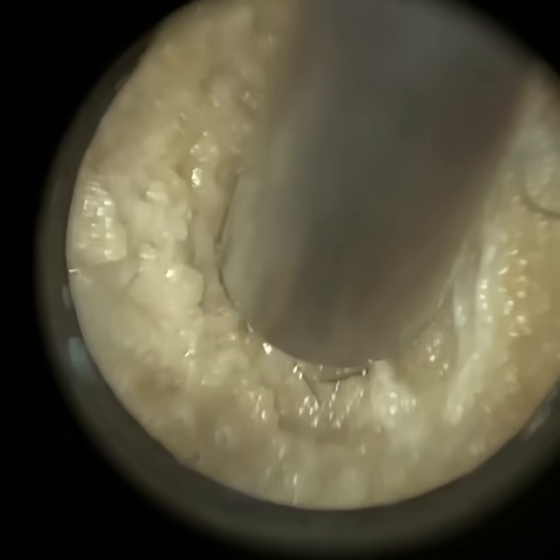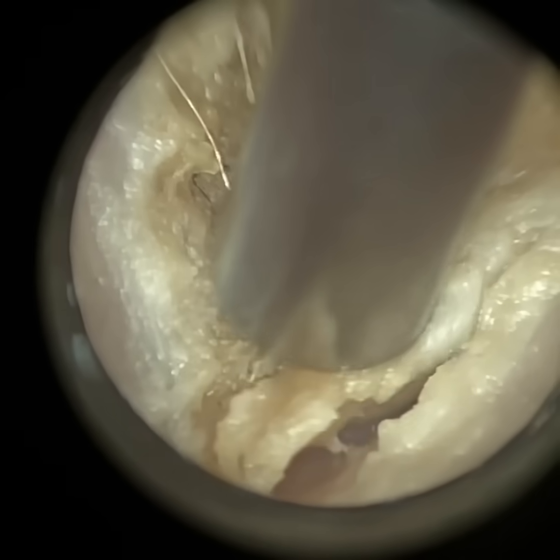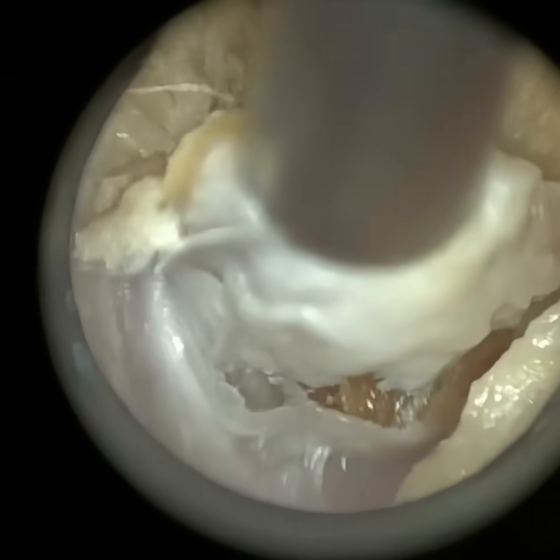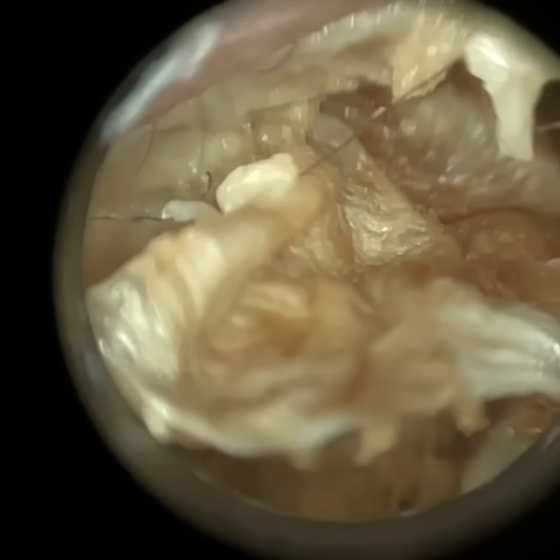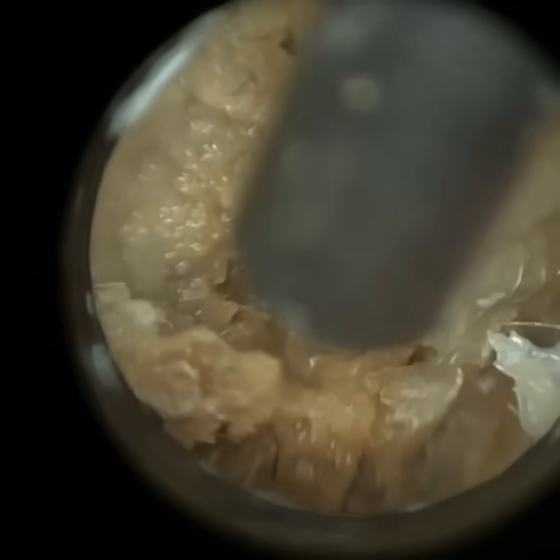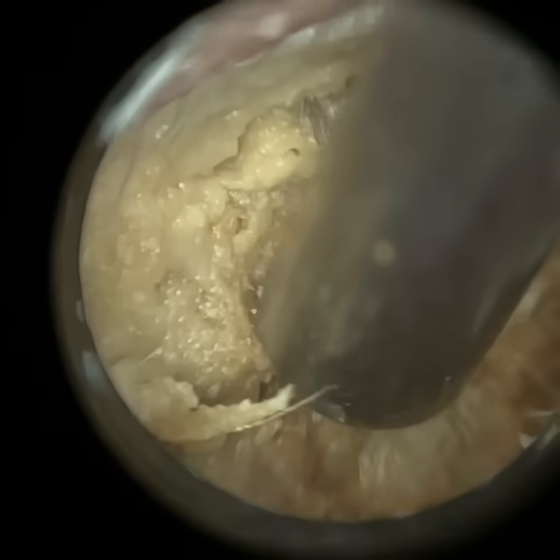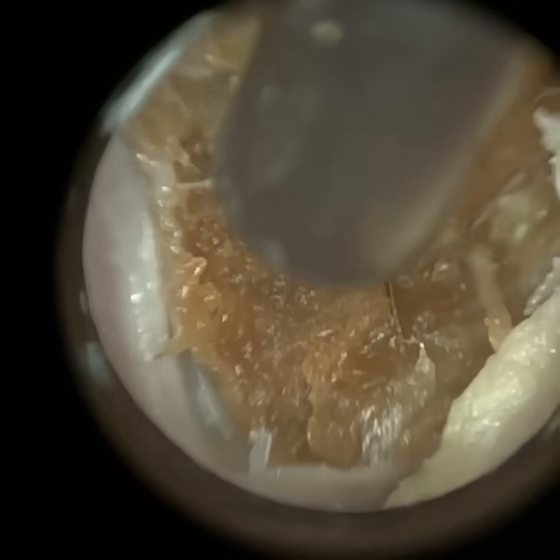This is a patient of mine who I've been treating for the best part of 10 years, and they've never really had such problems as they have on attending this appointment, where they presented with otitis externa. They've always had a bit of non-occluding earwax. This patient recently started swimming on a regular basis and felt that something wasn't quite right with their ears, possibly related to the swimming.